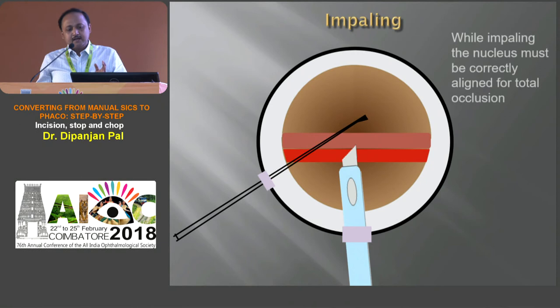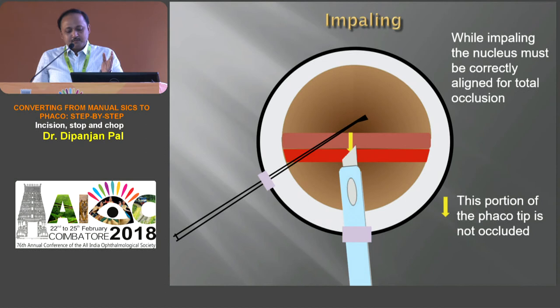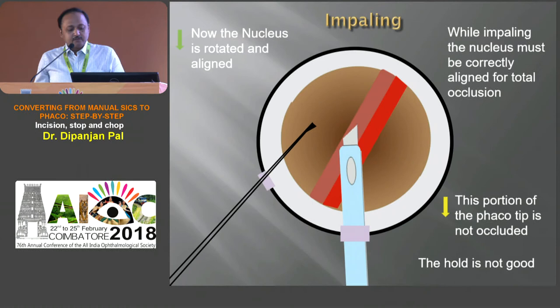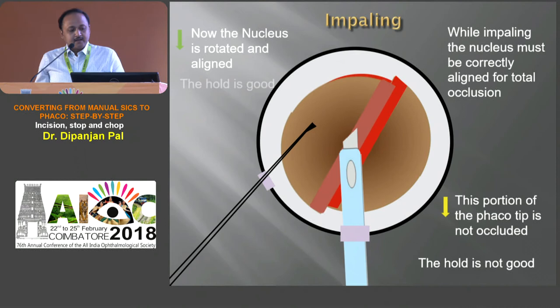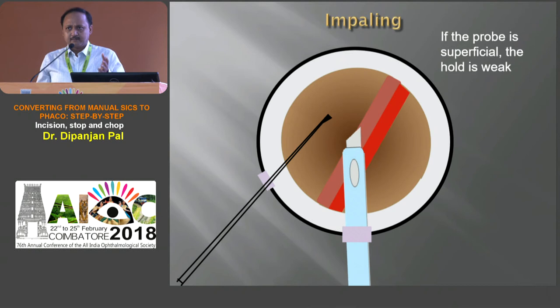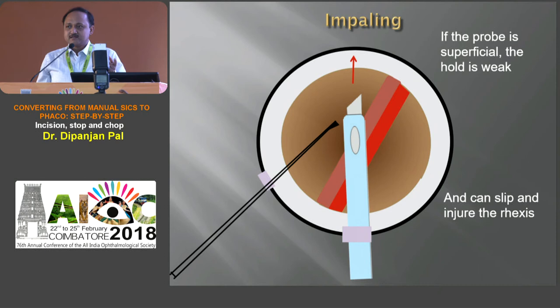For impaling, proper alignment of the phaco probe along with the part to be impaled is very essential. If the phaco tip is not properly occluded, it is difficult to get a proper chop. The moment we align the nucleus along with the bevel of the tip so it is properly aligned and occluded, we can initiate the chop. If the probe is superficial, the hold is weak and there is always a chance it can slip and injure your rhexis, which can extend into a PC rent.